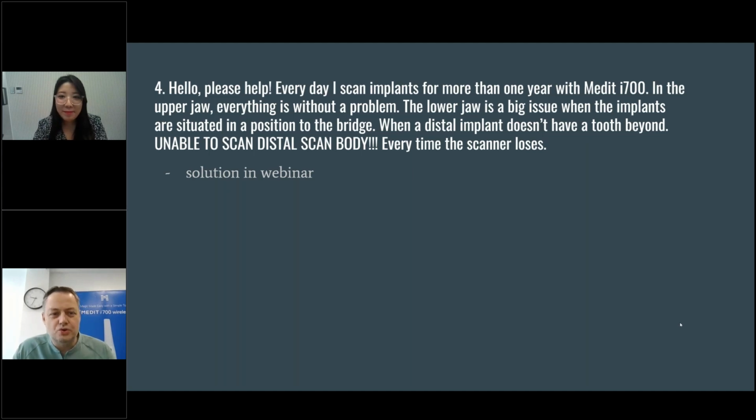What you do in this scanning is in the pre-op stage, and when you finish the pre-op stage, you copy this data to the op stage. You remove the resin cements or the flowable cements that you've placed. You delete them from your scan. You block everything, because now you have precise information on the pre-op that is copied to the op, and now you just complete the data of the op rescanning.